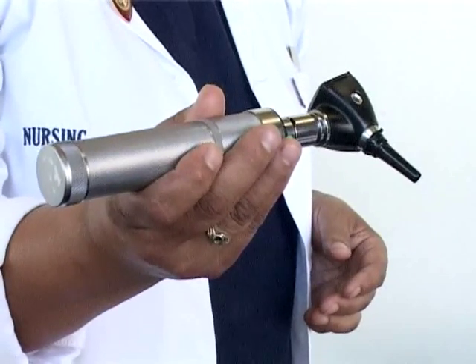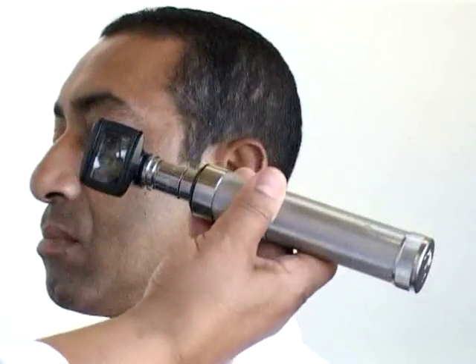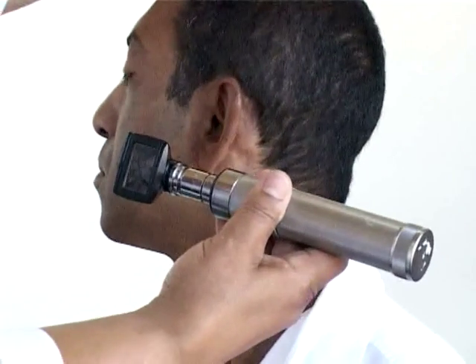When you insert the otoscope into the patient's ear, remember it must be inserted carefully and gently.